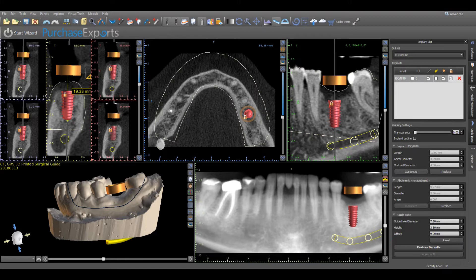This measurement will then be saved and can be referenced at any time. It is important to note that an additional 1.7mm needs to be added to this measured length if a narrow GRS drill sleeve will be used, or 1.5mm for a regular or wide GRS drill sleeve, to account for the flange height of a GRS drill sleeve above the guide tube upper platform.